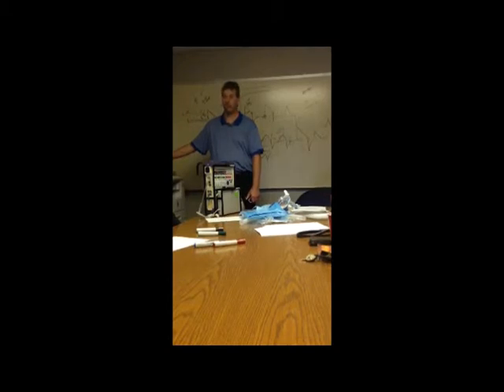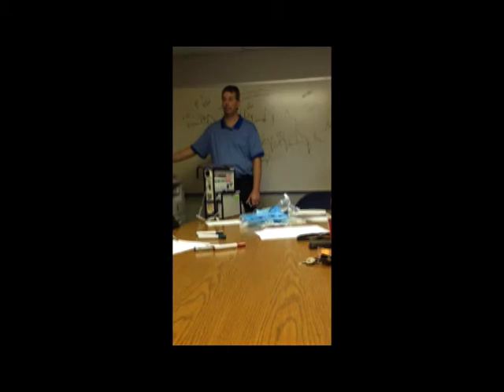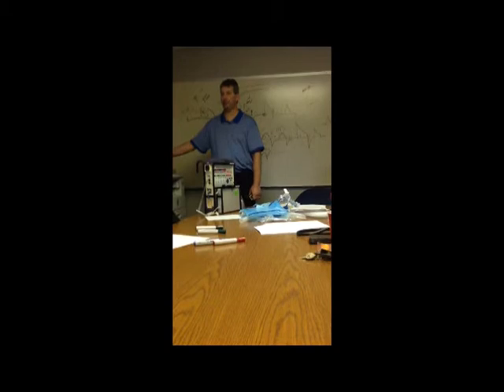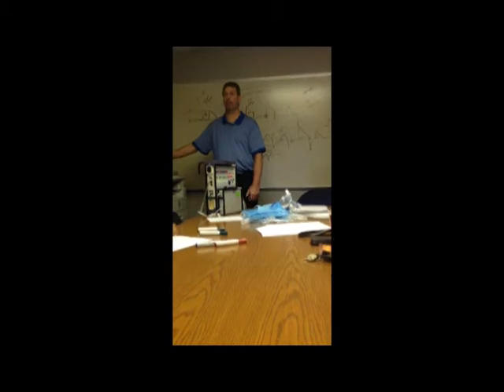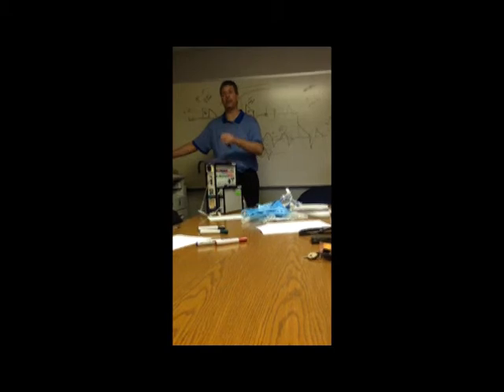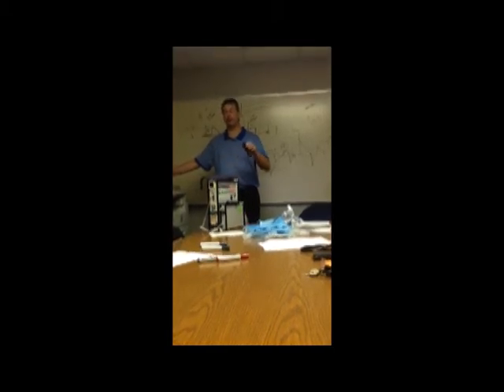So in triaging a patient, just to kind of put all this picture together, if we're getting someone from Thomasville or Lexington, they're like, yeah, they're 12 over 5, but they're breathing 30 times a minute and their SAT's 92%. You already have in your mind that you're probably going to be going up on the IPAP. Exactly, yeah. Because based on the 30 breaths a minute, I can, when I'm triaging and reading these numbers, it helps to put that picture together. I already know what I'm thinking. I would think the exact same way. And the piece that they told me that made me think that is the 30 breaths a minute. 92 I'm fine with.